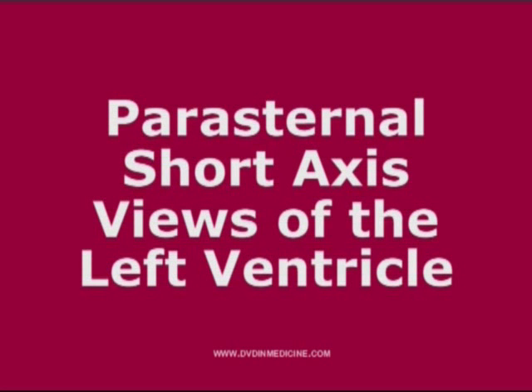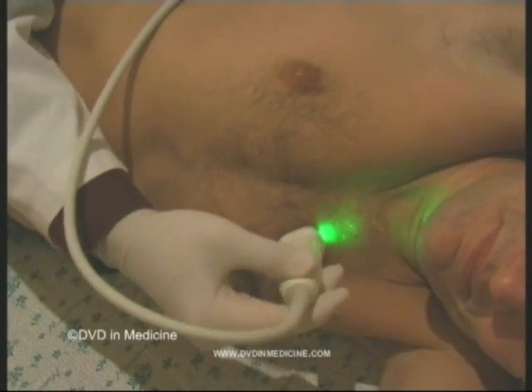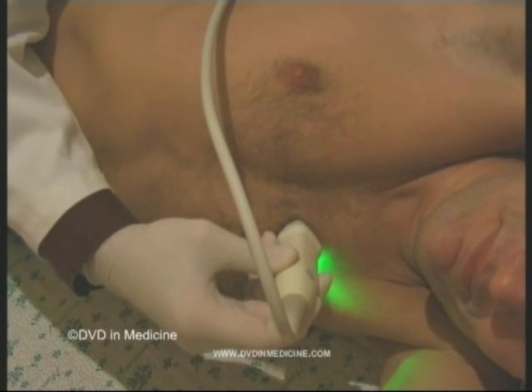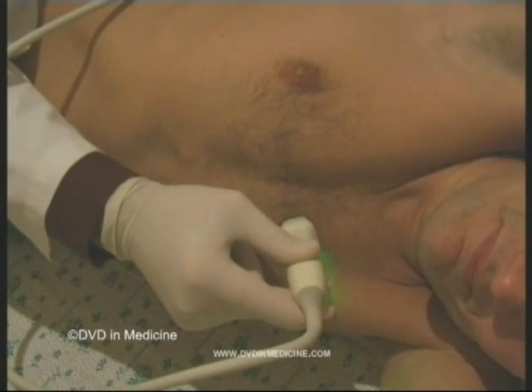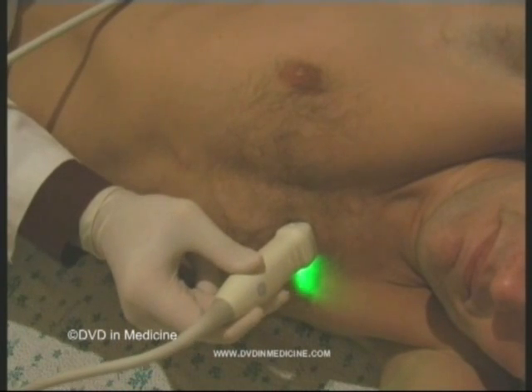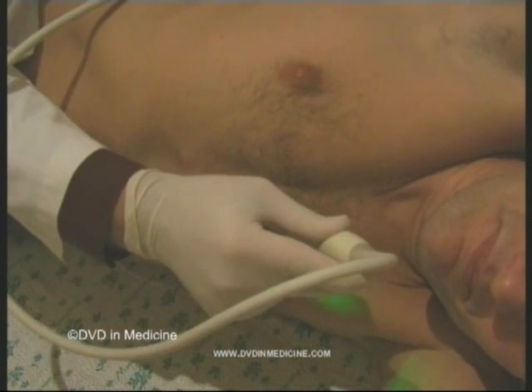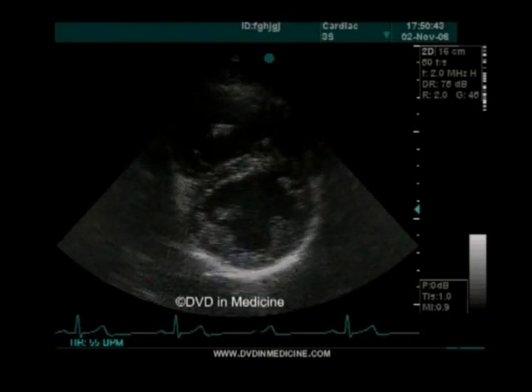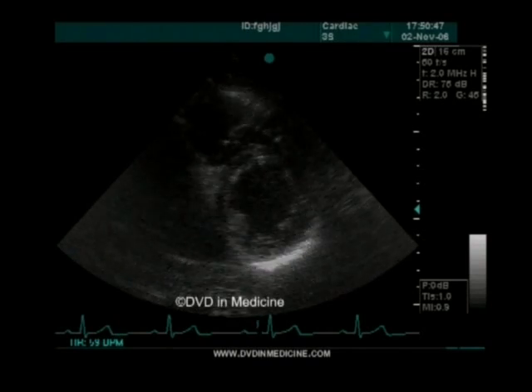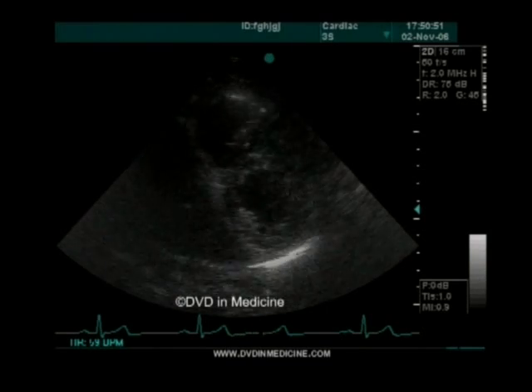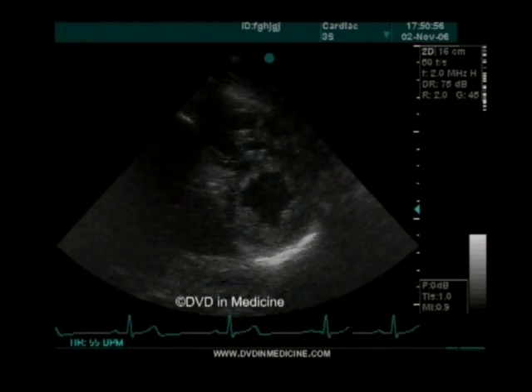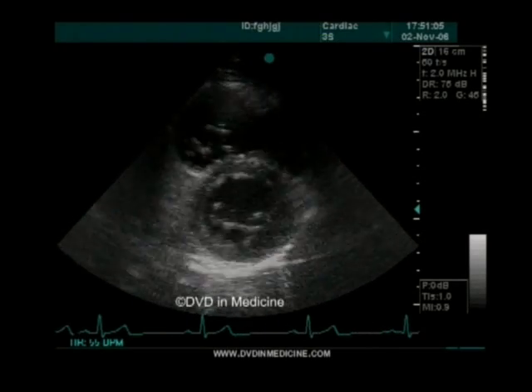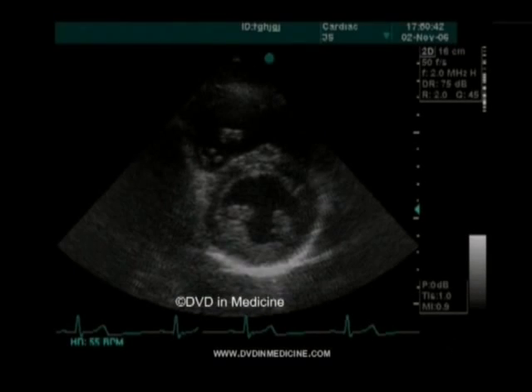Parasternal short axis views of the left ventricle. After one has obtained the parasternal long axis view of the left ventricle, one can rotate the transducer clockwise until the scanning plane is perpendicular to the long axis of the heart. After this step, one can sweep the transducer as if trying to look under the suprasternal notch, or sweep downwards in the direction of the apex, obtaining many cross-sectional images of the left ventricle. If the transducer is perpendicular to the anterior thoracic wall and the scanning plane is perpendicular to the long axis of the left ventricle, one will obtain the parasternal short axis view at the papillary muscles level.